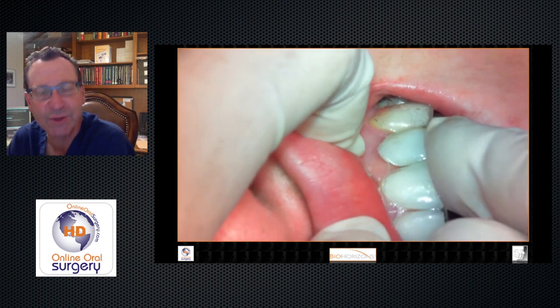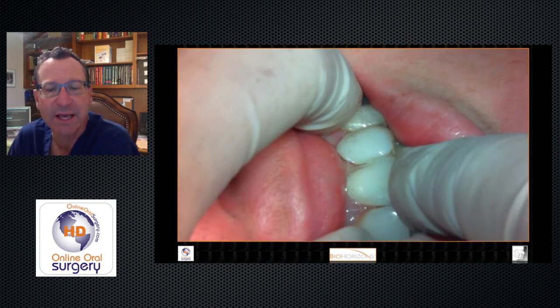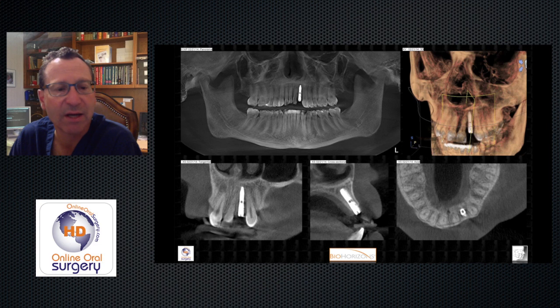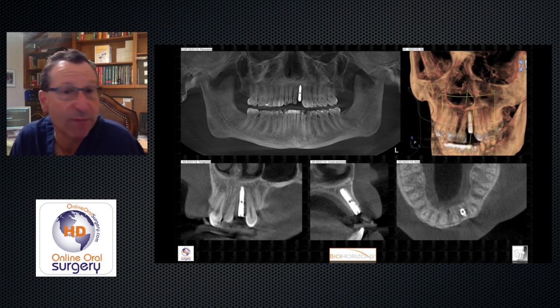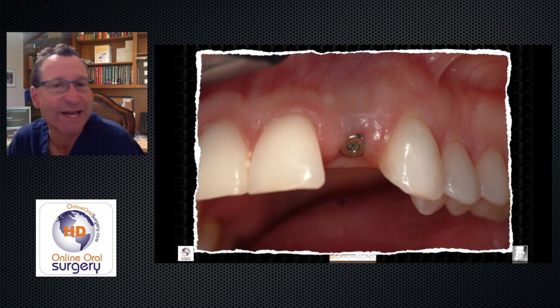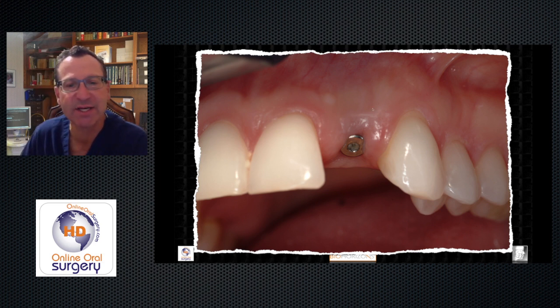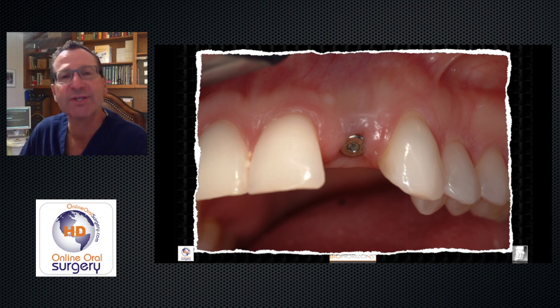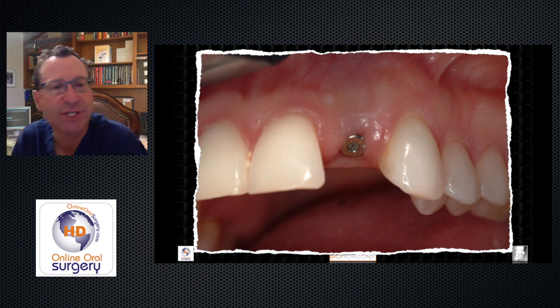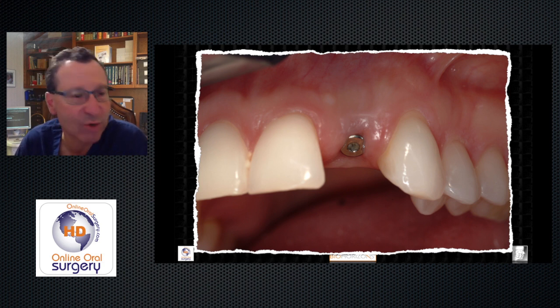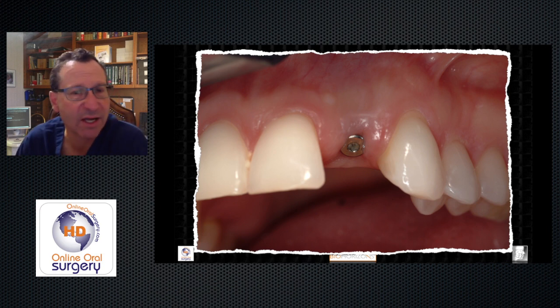The surgical guide comes out and we can look at our implant in place — it's perfectly positioned at the ideal depth. We adjust the final timing with our torque wrench and final depth of placement, about two to three millimeters subgingival at the bony crest. We take out our implant driver, check with a perio probe — just at about three millimeters — lots of irrigation to make sure there's no debris. We place a healing abutment, tightened to about 20 Newton-centimeters. No bone grafting was needed when we took the tooth out. The Essex bridge gives her a nice aesthetic provisional restoration. Post-op imaging shows perfect implant placement with perfect spacing. At her three-and-a-half-month post-op check, we have nice soft tissue contours, the healing abutment is about three millimeters, and papillas are developing. She's now at college in New York City having her restorative work done.